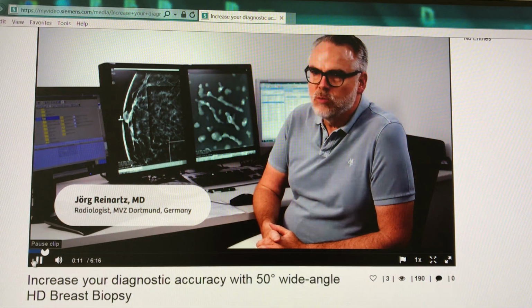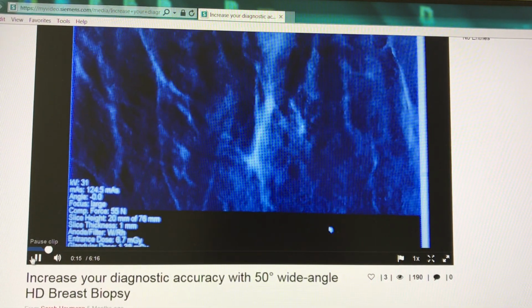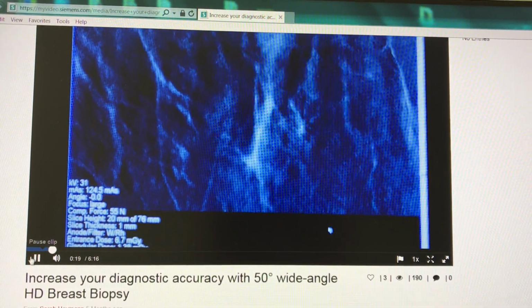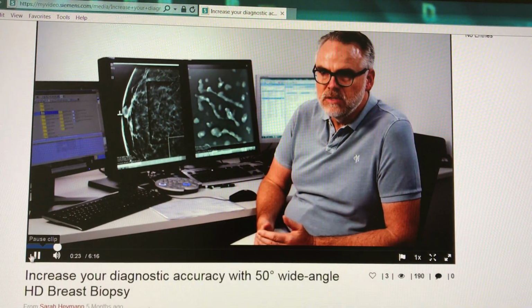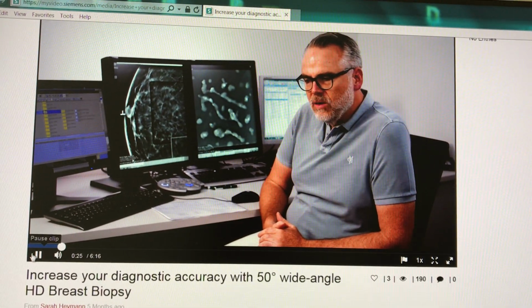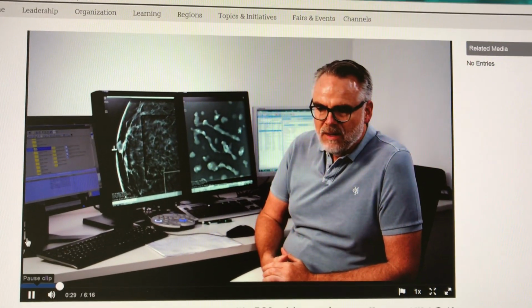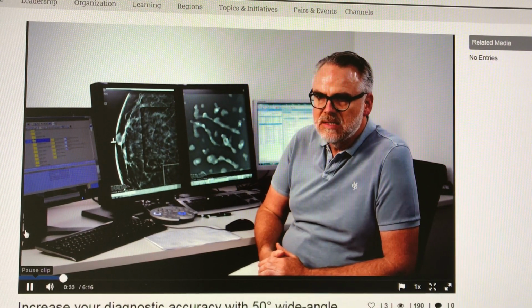For this patient, we detected a cluster of microcalcifications during routine mammography screening. This is a really fine, granular, newly formed microcalcification group. It's the kind of calcification that we need to further examine, as it undoubtedly represents a problem given the size and visibility of the calcification.